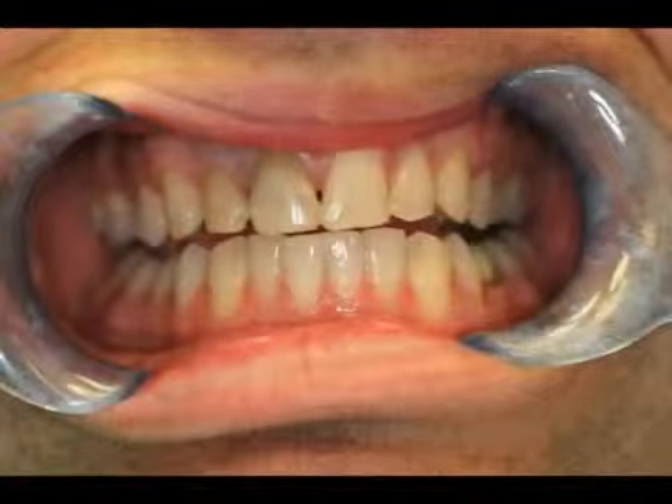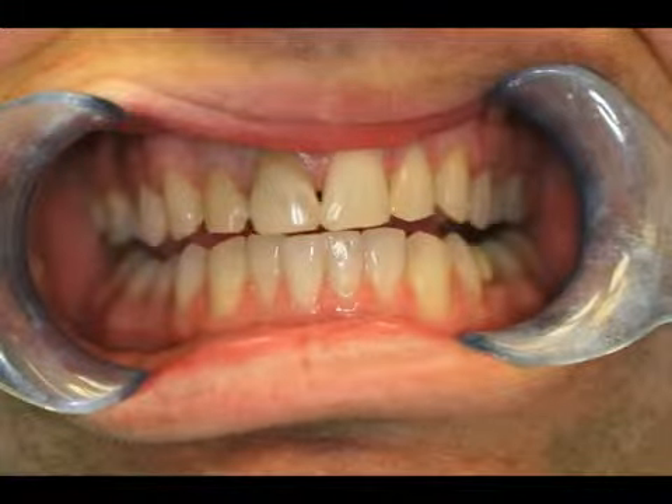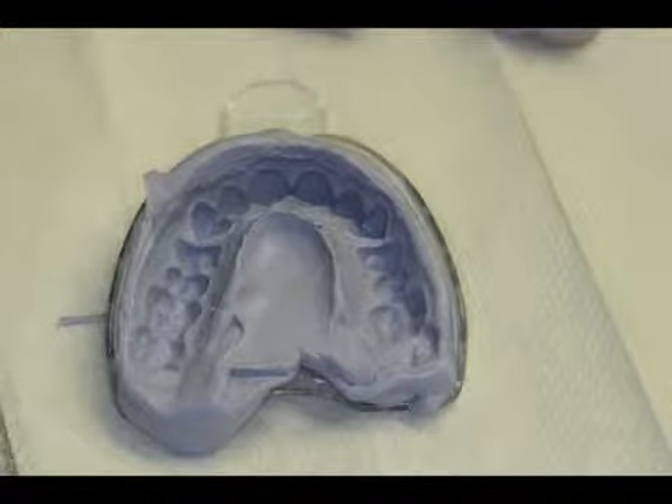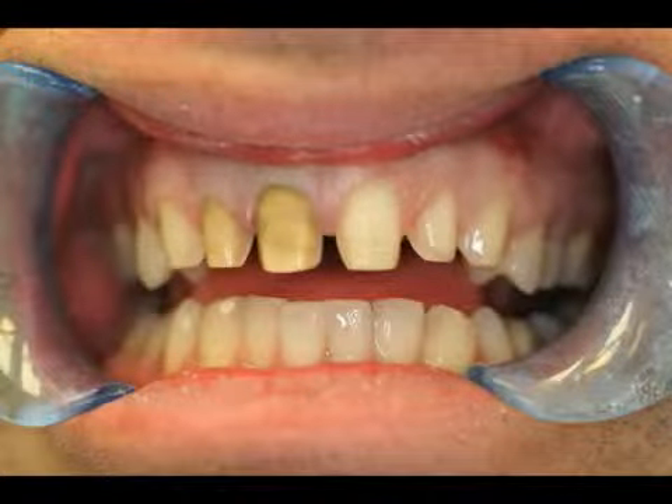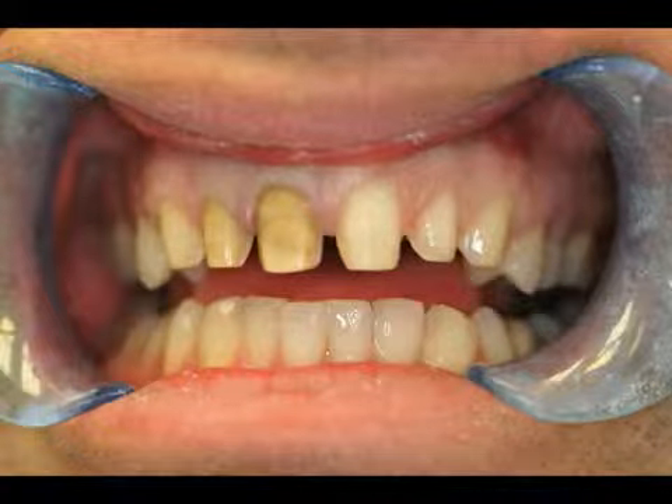The first step in making a provisional with ProTemp Plus involves taking an impression of the intact teeth to serve as a matrix for fabricating the temporary restoration. After the desired teeth have been prepared, the fabrication of the temporary can begin.